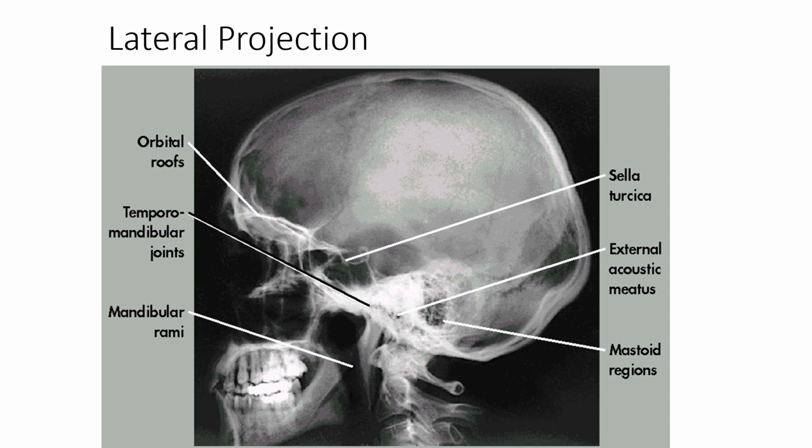You should see all the occipital bone, and the occipital bone, that border of the skull, should carry forward all the way through to junction with C1, and then into the temporal bone and the EAM, okay, where the middle and anterior sections of the cranial floor come out of the EAM and the temporal bone region.